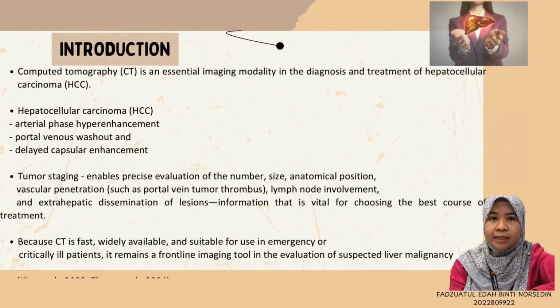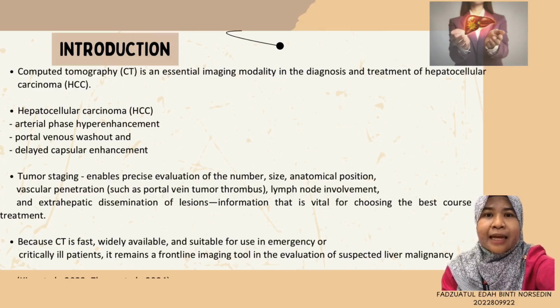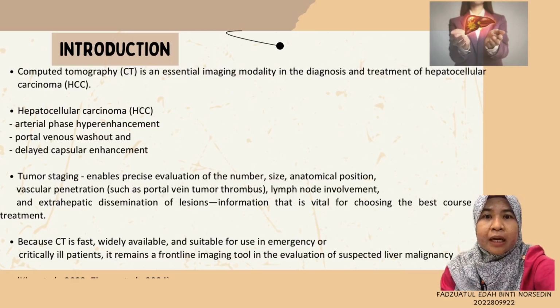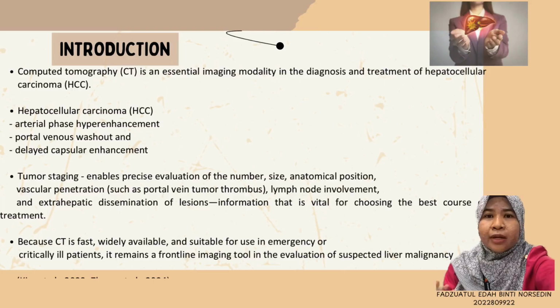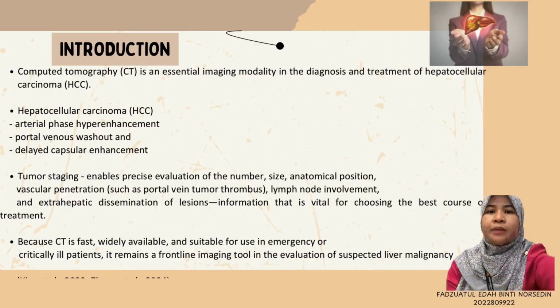Due to the tumor's characteristic vascular behavior on contrast-enhanced studies, computed tomography (CT) is an essential imaging modality in the diagnosis and treatment of hepatocellular carcinoma (HCC). HCC usually shows arterial phase hyperenhancement followed by portal venous washout and delayed capsular enhancement. These traits allow for a non-invasive diagnosis in high-risk patients without the need for a biopsy.